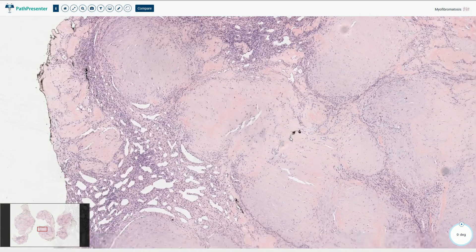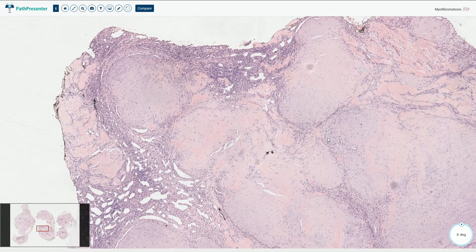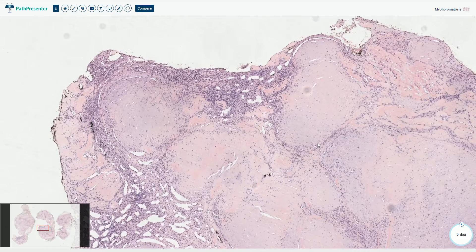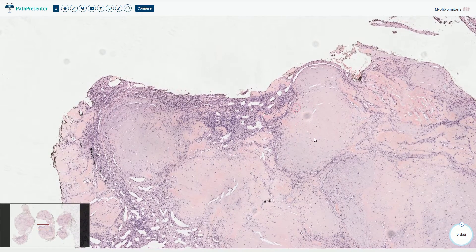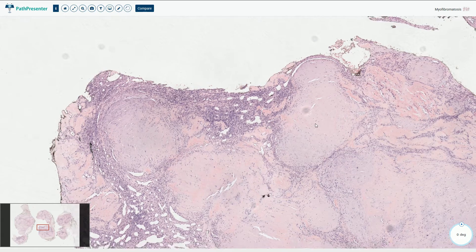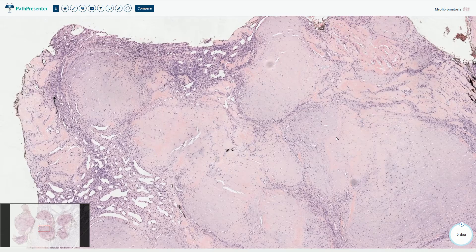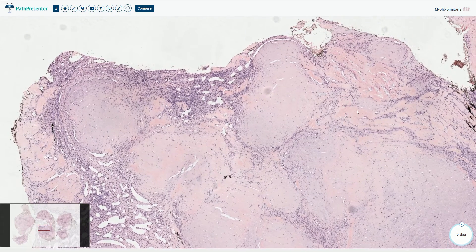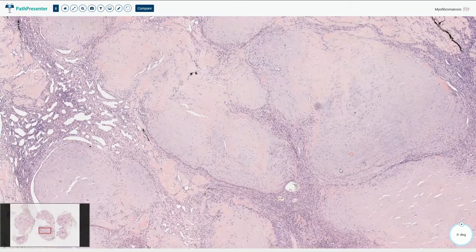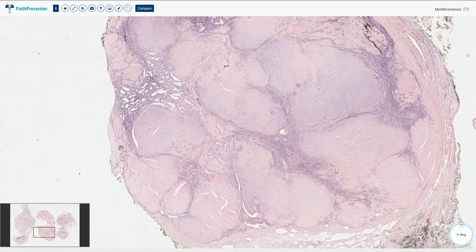Immunohistochemically, these lesions may be positive for smooth muscle actin and calponin; however, desmin and other markers of muscle differentiation are usually negative. S100 and cytokeratins are also negative — S100 being a marker of Schwann cell and melanocytic differentiation, and cytokeratins being markers of epithelial differentiation, so all of those stains will be negative in myofibroma.